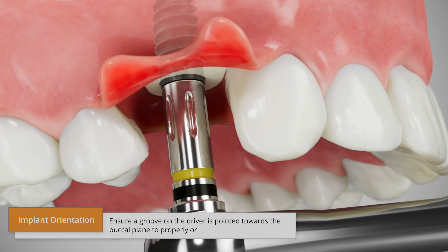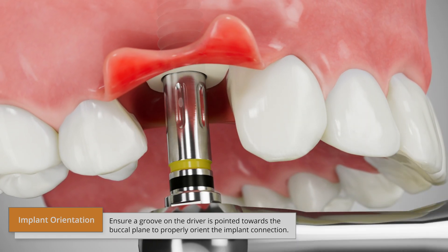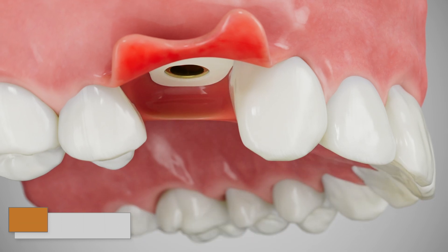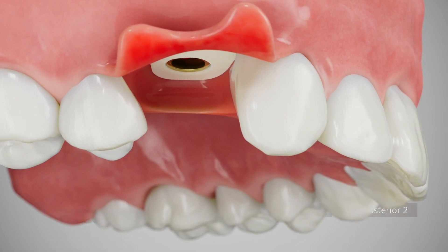Once a BioHorizons implant has achieved primary stability, a SmartShape healer can be used as a single solution for soft tissue healing and impression taking.